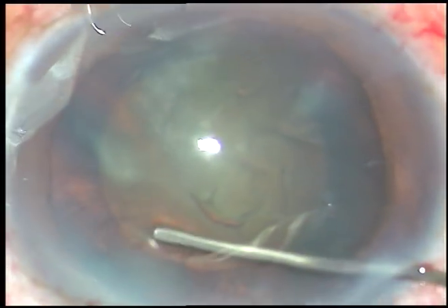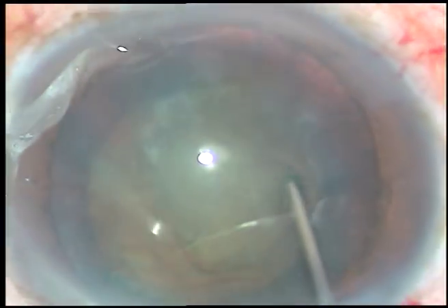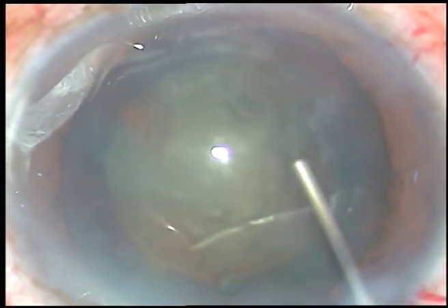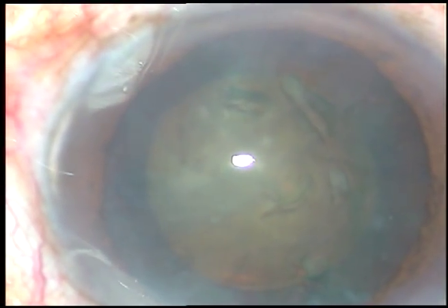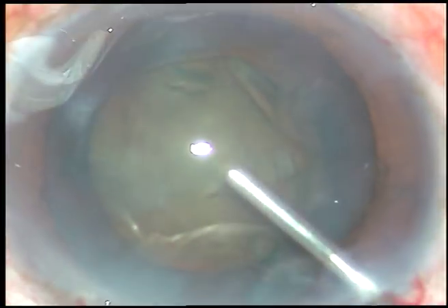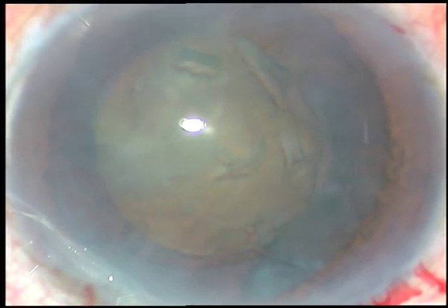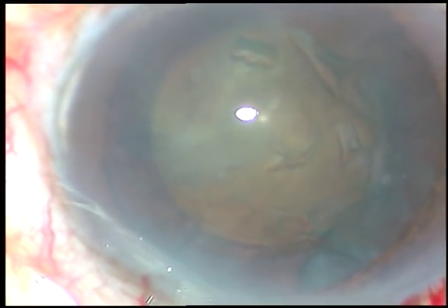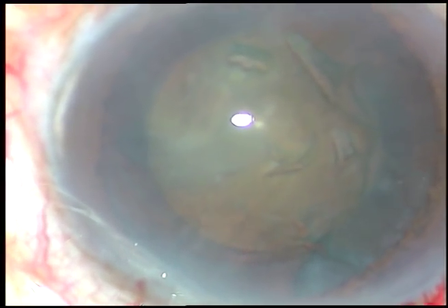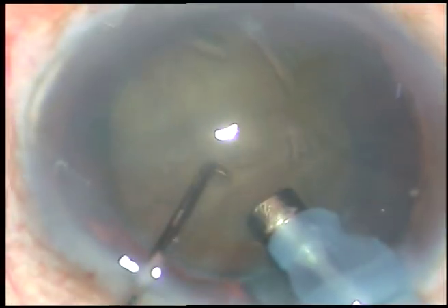Hydrodissection is done. Now is the time to introduce the tip of the phaco handpiece — visco has been injected. The machine being used is the Alcon Infiniti cataract phacoemulsification system.